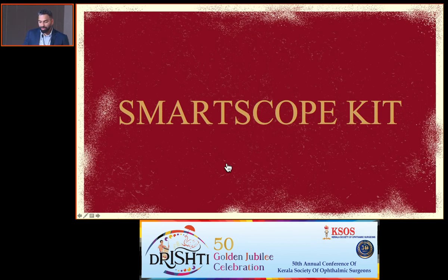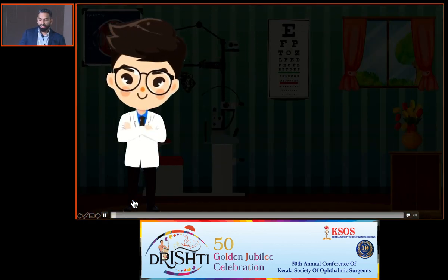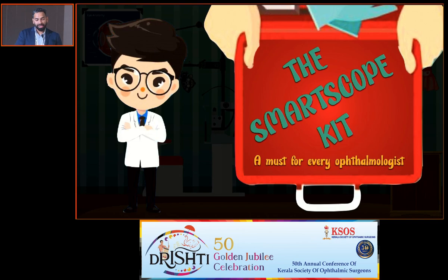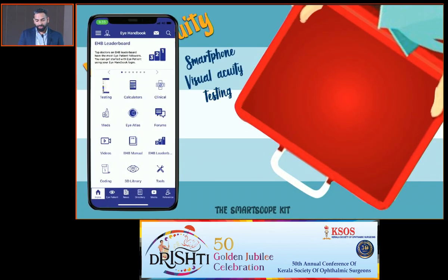Then we come to the smartscope kit. Basically what happened is, we thought if we can have ASPI and Slitscope in our community service, why not take all the devices which we have created and put them in one kit. So that is when the smartscope kit arose. This kit is a comprehensive ophthalmic kit which has almost all the devices which we use in our hospital. So the first one is the visual acuity.